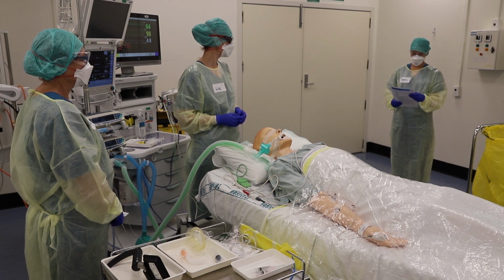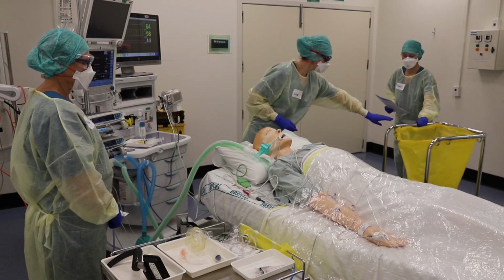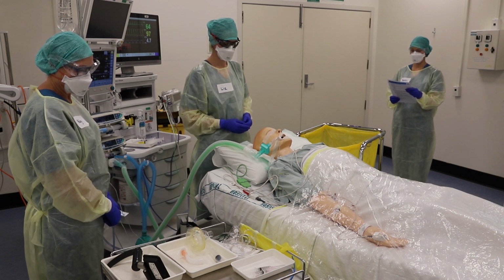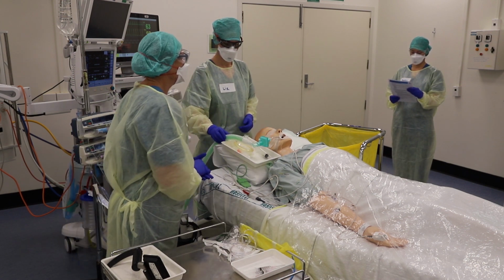Sure. Thank you. Rubbish bin on the left within easy reach of anaesthetist. Airway tray with face mask, Goodell and syringe on right side of patient's pillow. That's complete.